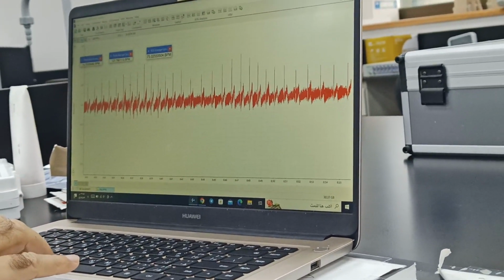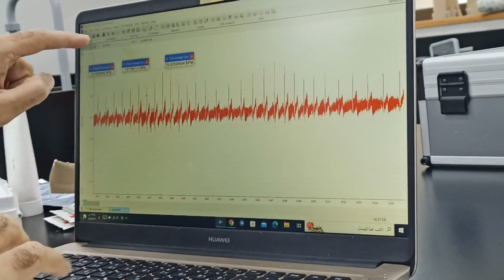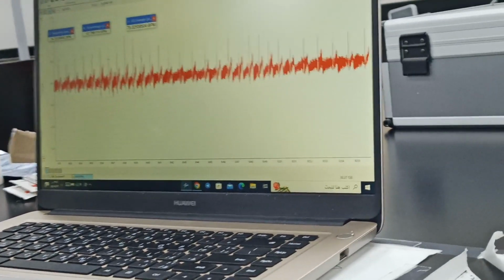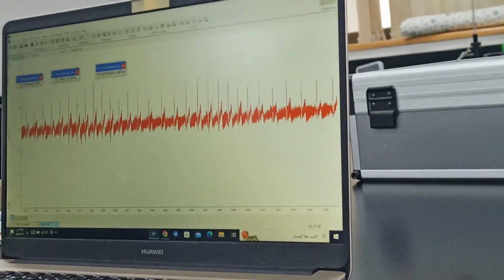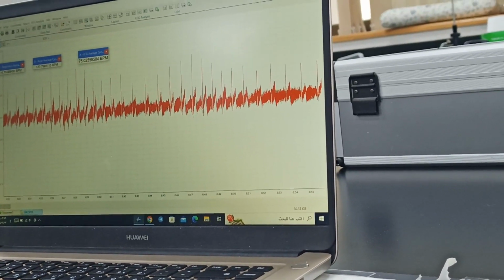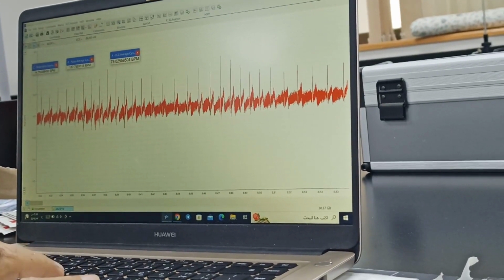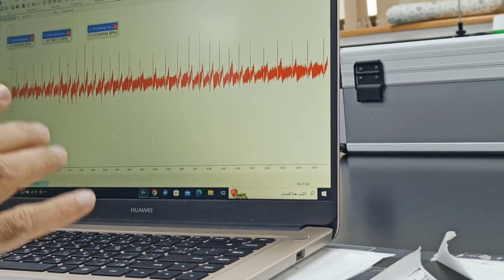All right. If you now bring the cursor to the next, here you get the timing between two successive R waves. So the time between two peaks is 0.752. How did we do this? What did we choose from the settings above? We have not chosen anything. We have just zoomed and brought a marker to one R wave and put the cursor onto the second, just to see the timing.